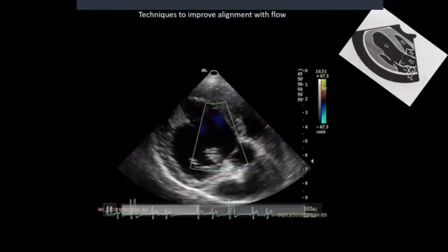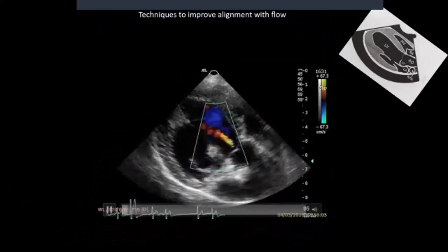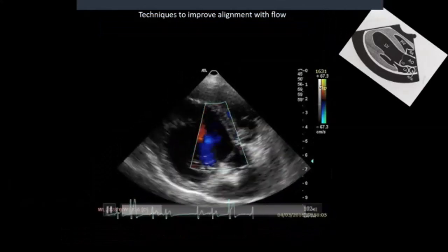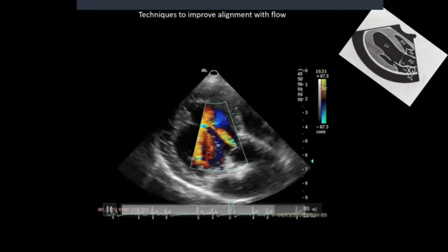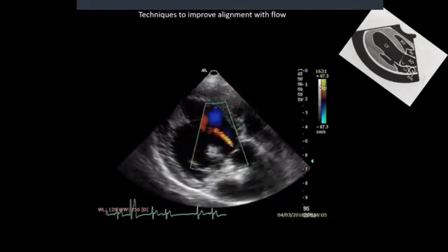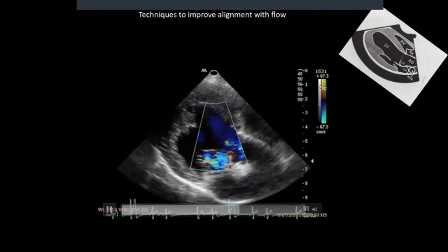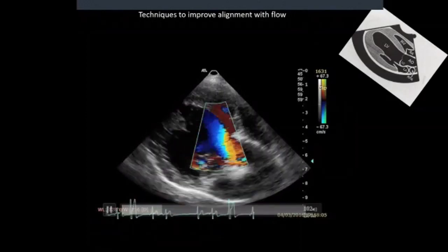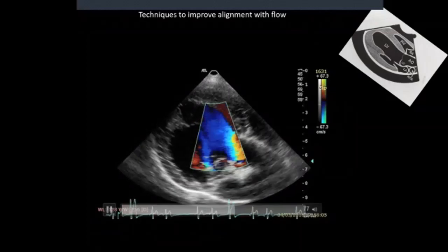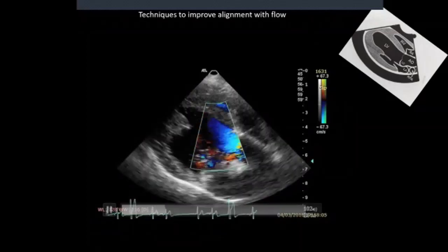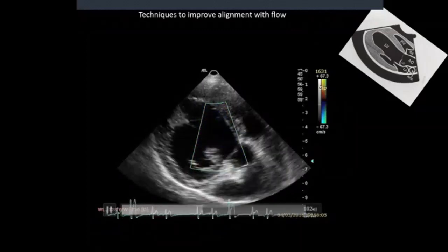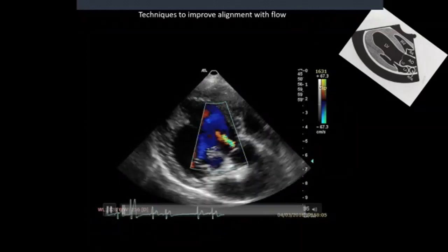Here's the same view again, but this one has aortic insufficiency. The red you can see is blood heading towards the probe — red towards — which represents aortic insufficiency. I've taken this standard view and tipped the heart up so I can actually interrogate this, because if that flow was perpendicular to the probe you're not going to get useful directional information from colour flow Doppler. This is a technique we use to improve alignment with flow.